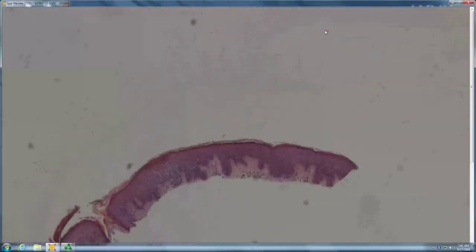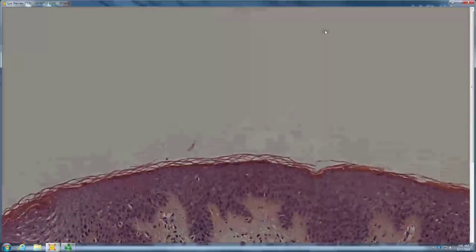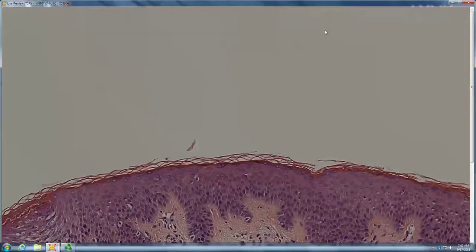It's like you have a basket weave stratum corneum. I've seen neutrophils. You have spongiosis. And is the corneum all basket weave? Well, it looks like there's a little compact beneath. So again, I guess tinea. And this is tinea again.